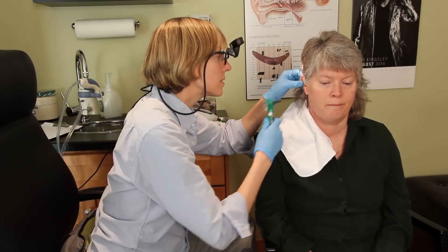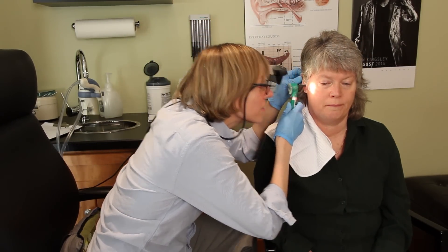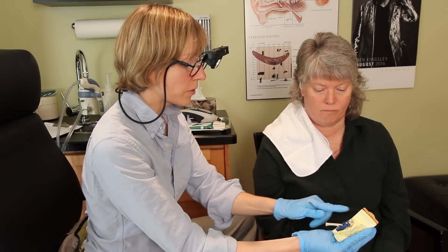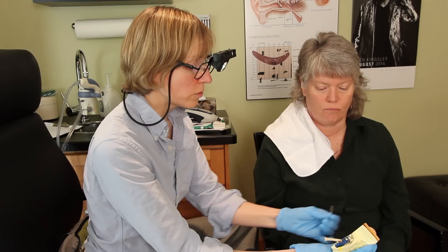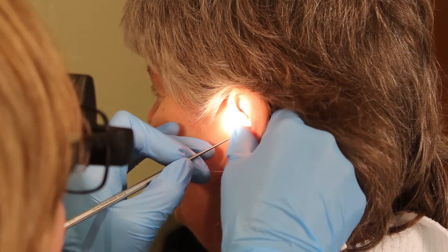An overabundance of naturally forming wax in the ear canal can be unhealthy and the cause of reduced hearing ability. Dr. Shannon McLean explains the methods of removing the unwanted wax to her patient before proceeding with a hearing test.